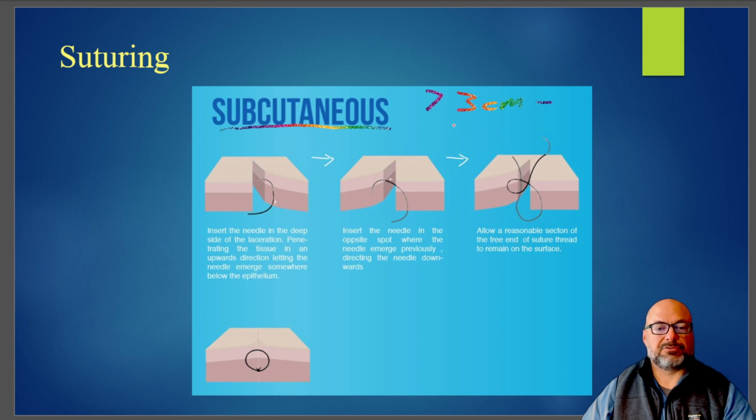I still typically do close it, even if it's quite thin. So if we're going to call this here the subcutaneous layer, and we'll say that this is skin here, I usually do close the subcutaneous layer. I think that it brings the skin edges together a little bit more nicely for doing a subcuticular closure of the skin, and takes some tension off the skin edges. It also, by closing off that potential space in the subcutaneous layer, reduces the risk of seroma and hematoma formation, which granted is a larger risk the deeper that space is.